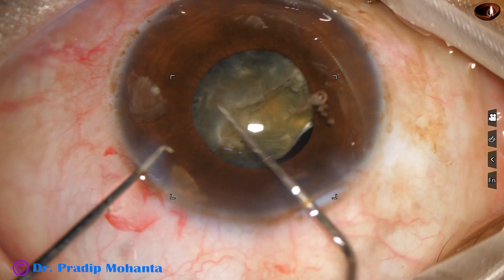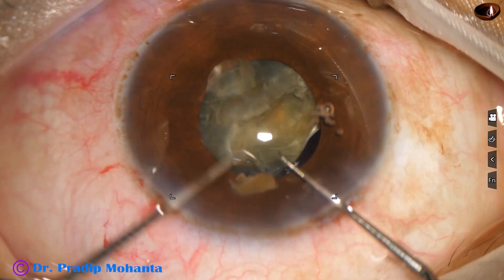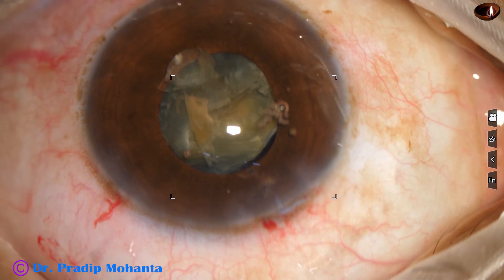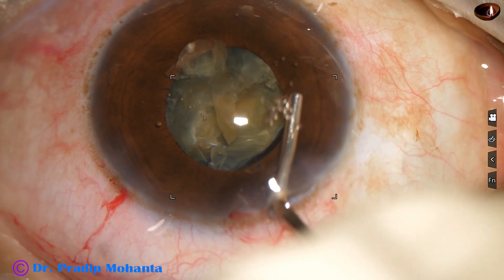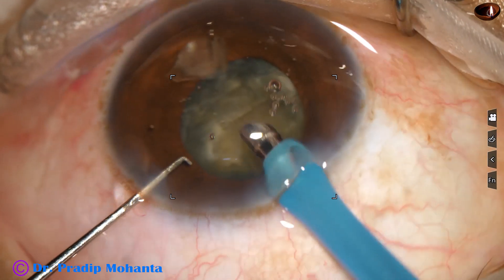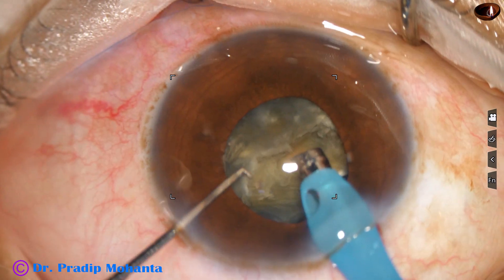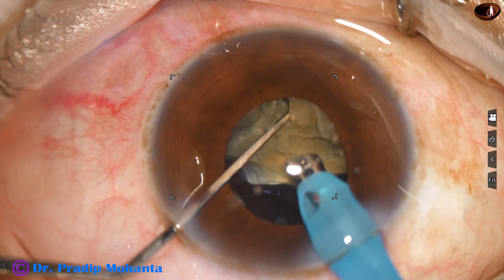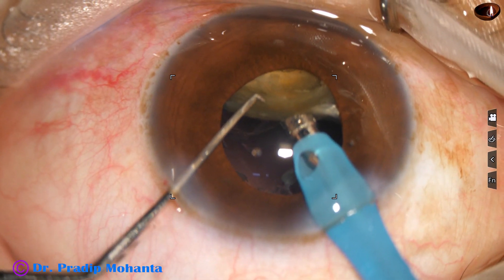I rotate this hemi-nucleus oriented in such a way that I can manage it easily. Two small pieces are placed at the central part. Now I inject visco in such a way that these smaller pieces do not go to the periphery. I go in and emulsify these two smaller pieces first — it is very important to emulsify these smaller pieces, otherwise they go underneath the iris and get hidden. Postoperatively, we may see them at 6 o'clock, and they cause a lot of corneal decompensation.